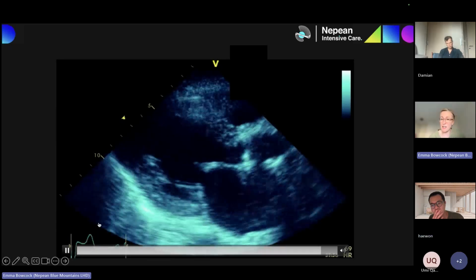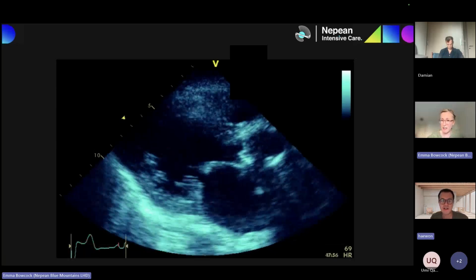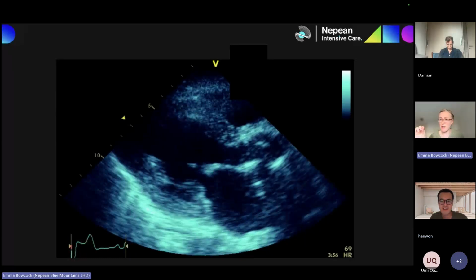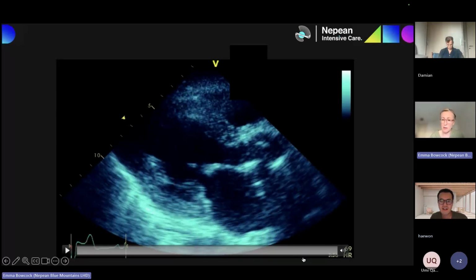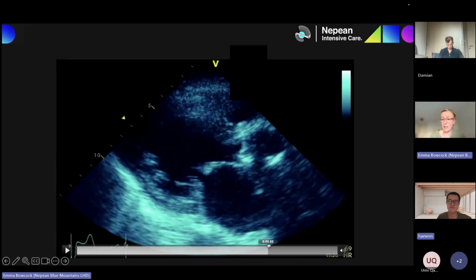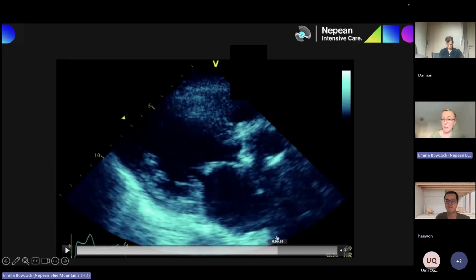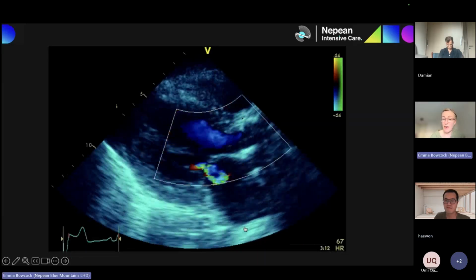Can you see that again as you're looking at it? You see how it's flicking into the LVOT. I think there was actual damage to the cusps of the valve during the procedure, which then got made worse by the balloon pump being in. And then I think you did reasonably well with this part.